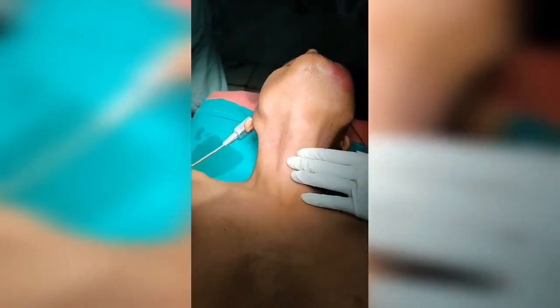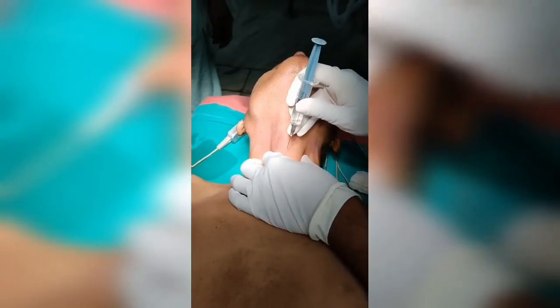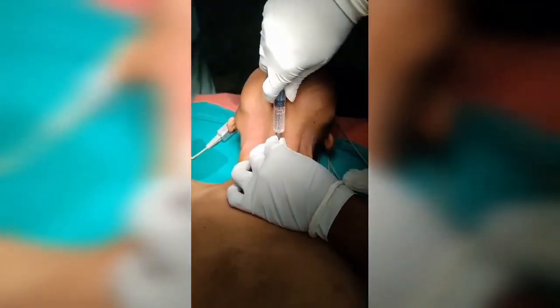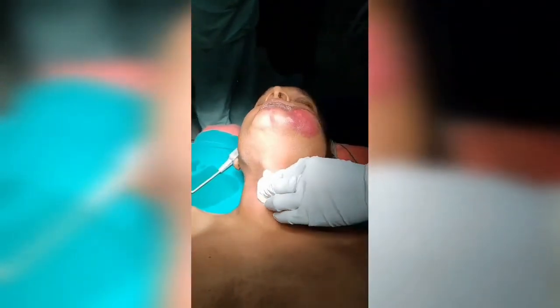The trachea is straddled with two fingers of the non-dominant hand, while with the dominant hand a 10 ml syringe containing 4 ml of 4% lidocaine attached to a 21 or 22 gauge needle is directed into position. The patient is asked to take a deep breath in, then exhale gently but maximally. Once exhalation is at completion, the anesthetic is rapidly injected as it enters the trachea. The patient may cough, but because exhalation has taken place, a quick breath is taken to inhale, which helps spread the anesthetic.